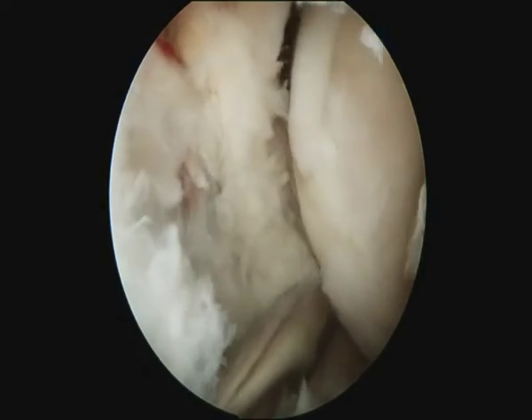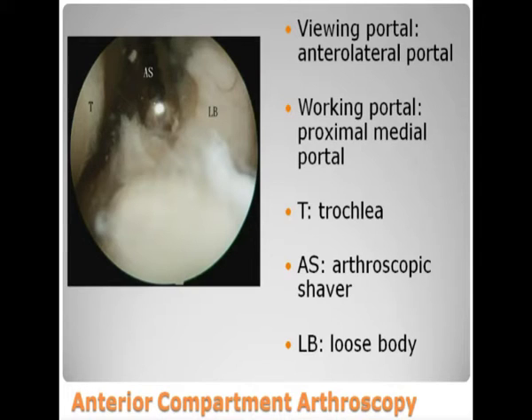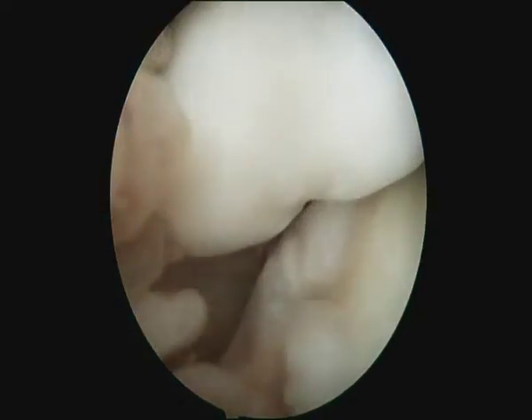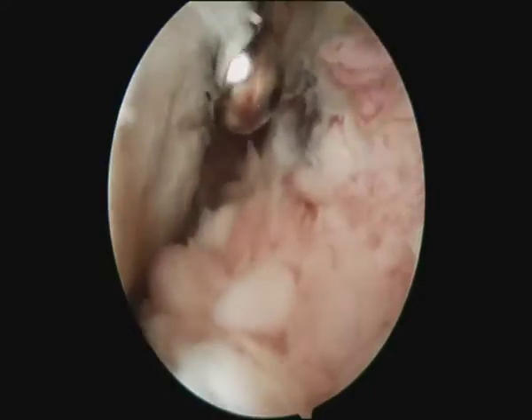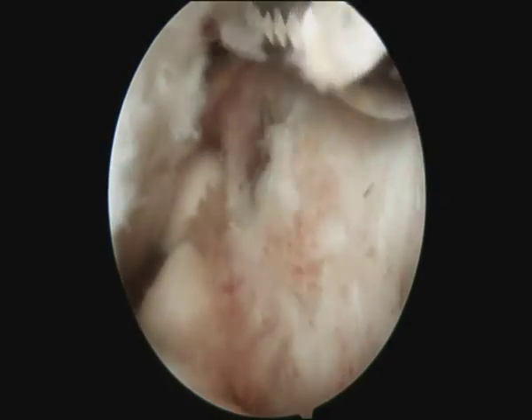Finally, anterior compartment arthroscopy is performed through the proximal medial and anterior lateral portals. With the anterior lateral portal as the viewing portal and the proximal medial portal as the working portal, the loose body and inflamed synovium are removed.